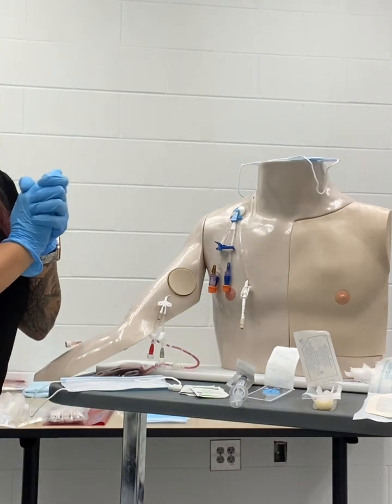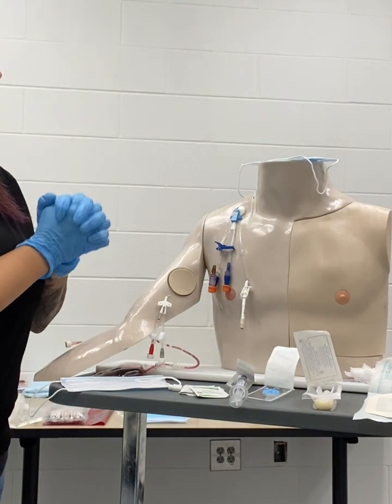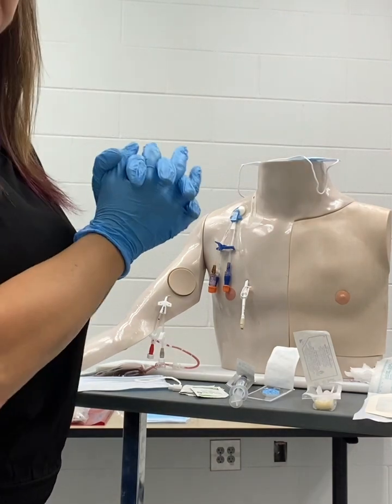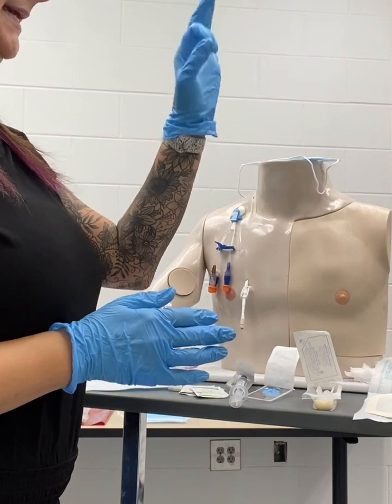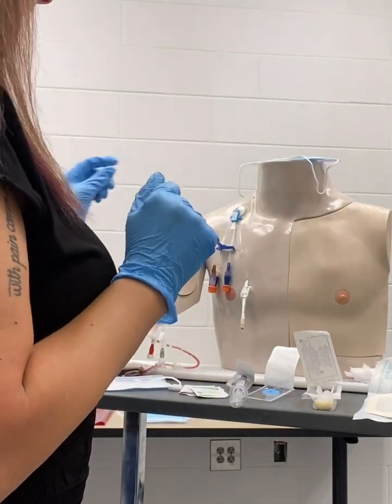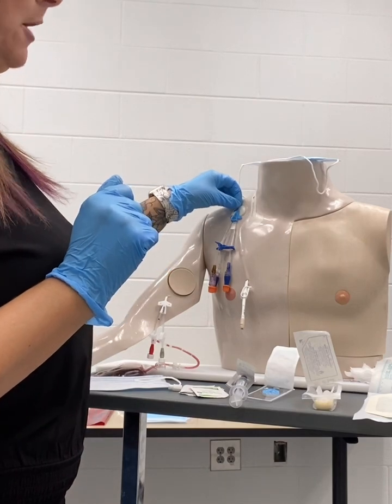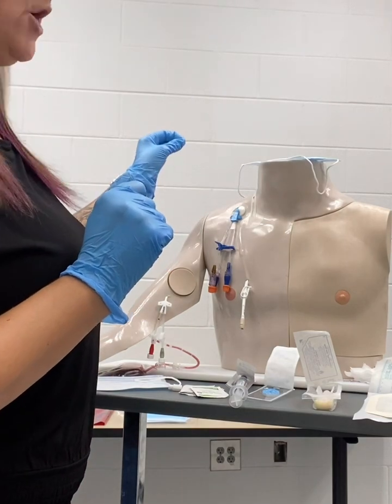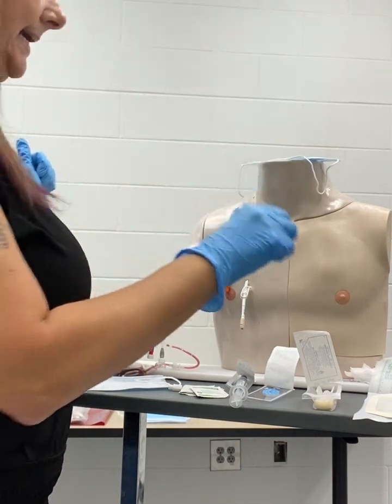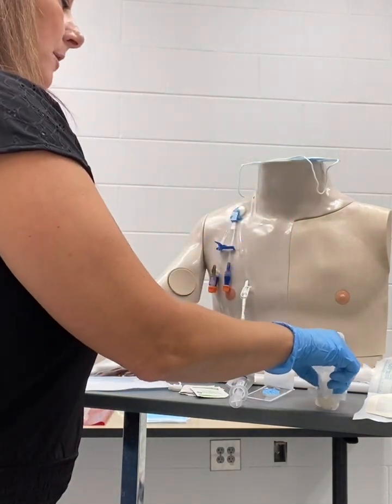At this point we want to don sterile gloves. After I have my sterile gloves on, I'm going to go ahead and get ready to begin the procedure. One hand will be clean, one hand will be sterile. I'm going to go ahead and remove the bio patch with my non-dominant hand and discard that. I'm going to take my sterile dominant hand and grab my first chloroprep.